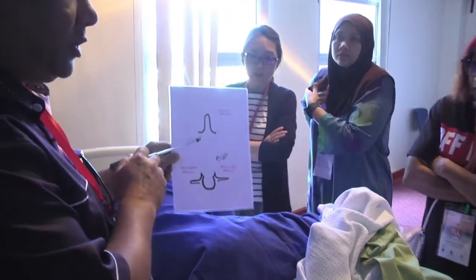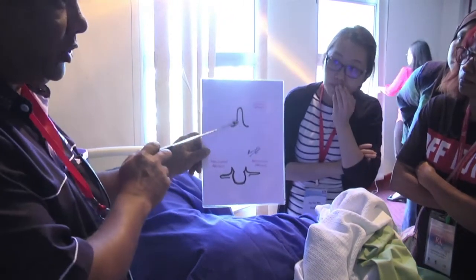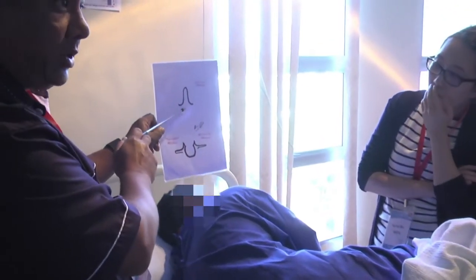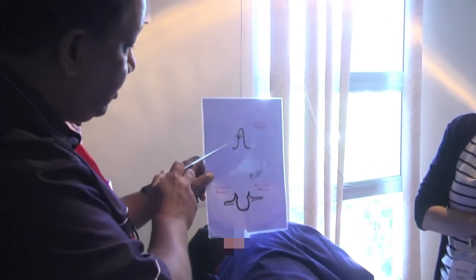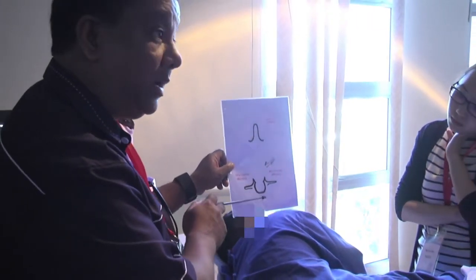This is a transverse spinous process view. You will see a bright dot and there will be an acoustic shadow that will be consistent with what a spinous process looks like in the transverse view. It is a transverse interspinous view. Now see, the spinous process disappeared here, but now you are seeing other osseous elements.